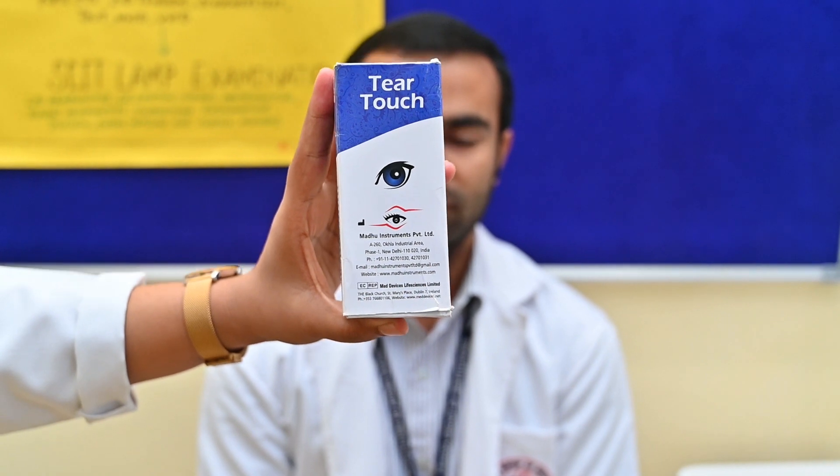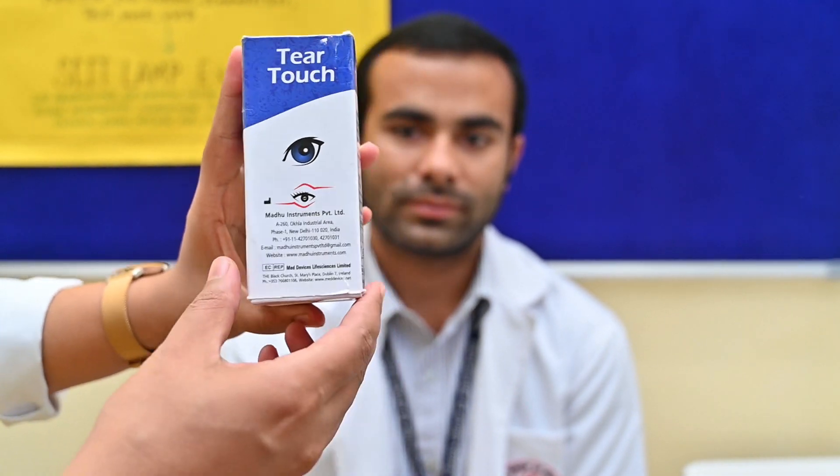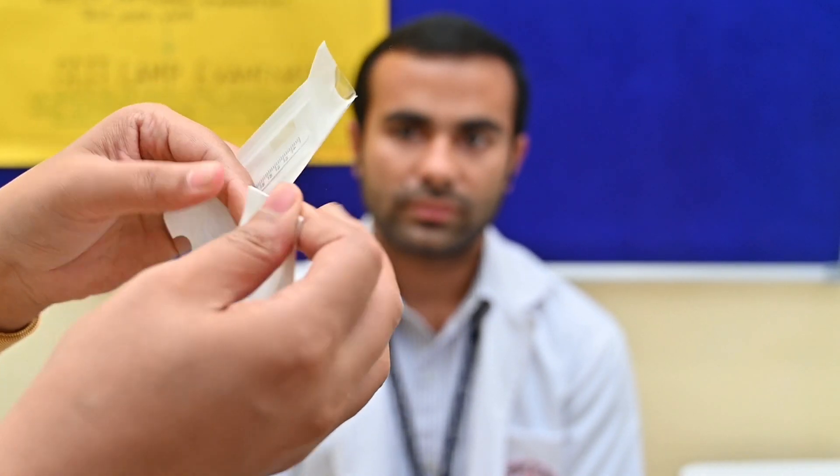Please come closer. Let me show you practically how you will do a tear evaluation test. This is a tear strip box — Schirmer tear test strips. The strips will be like this inside. The strip dimensions are 35 mm in length and 5 mm in breadth. This is filter paper number 41. You have to fold this at the corners like this. You should never touch the tip because when you are placing this in the patient's eye, it may cause a burning sensation.